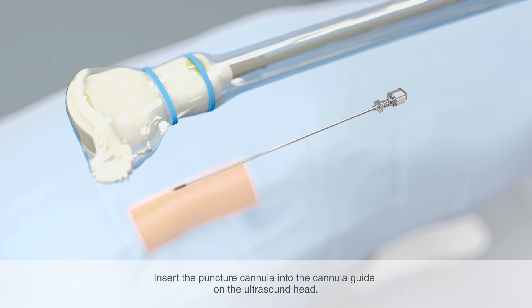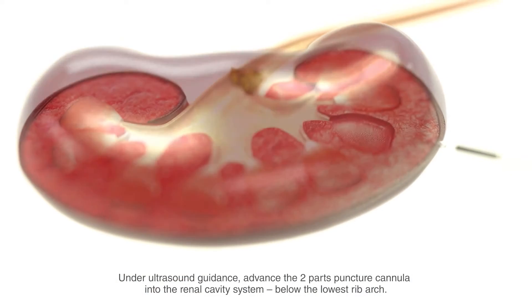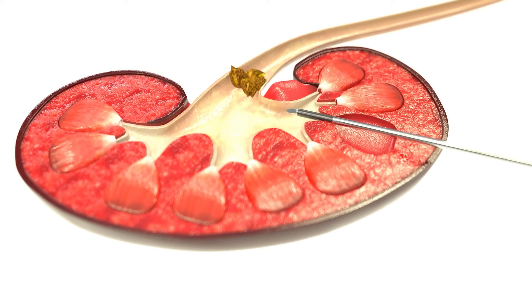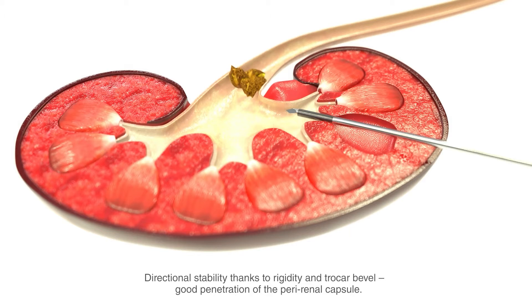Insert the puncture cannula into the cannula guide on the ultrasound head. Now advance the two-part puncture cannula under ultrasound guidance into the renal cavity system. Ensure that the puncture cannula is always inserted below the lowest rib arch. The puncture angle to the frontal plane of the body is about 30 to 40 degrees. The puncture should be strictly radial, that is to say perpendicular to the renal surface and through a renal calyx. The puncture cannula has high directional stability thanks to its rigidity and the trocar bevel, thus ensuring good penetration of the perirenal capsule.